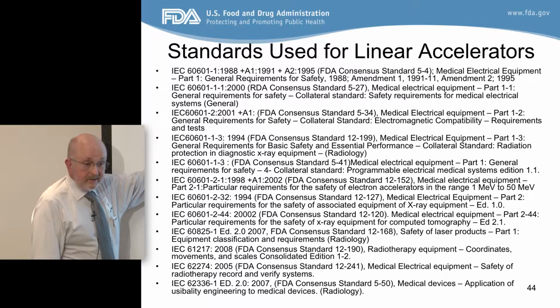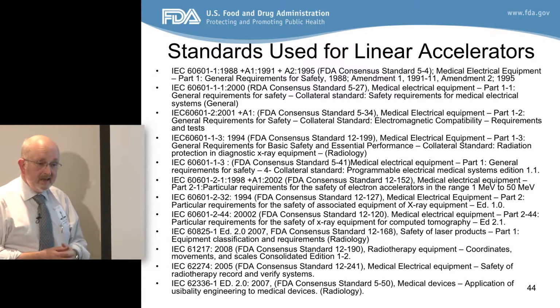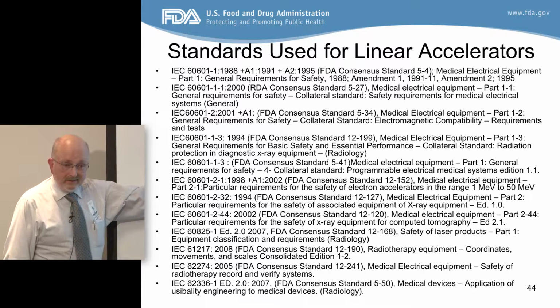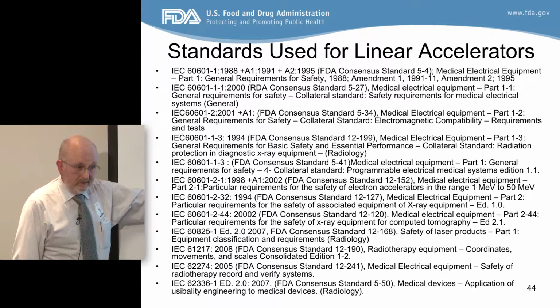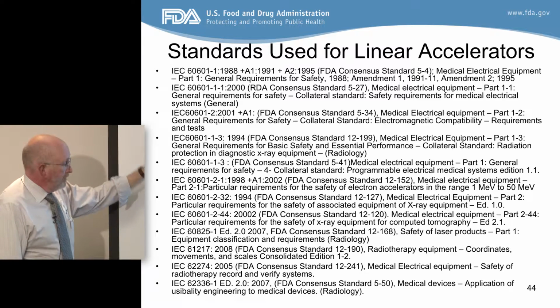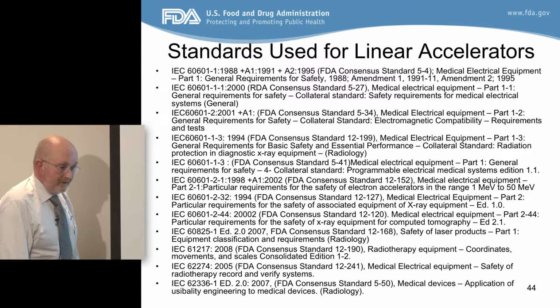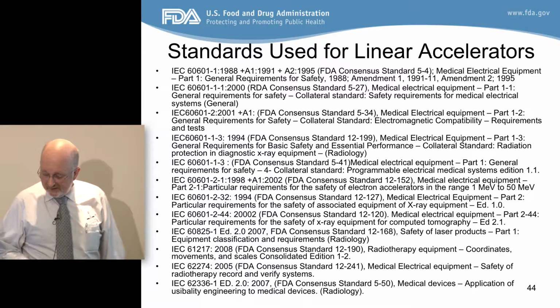It gives the reviewer, our review scientists, greater confidence once they know that these standards are being used to develop these linear accelerators. And I think I got them all. I think this is the whole list of standards that we look for with linear accelerators.